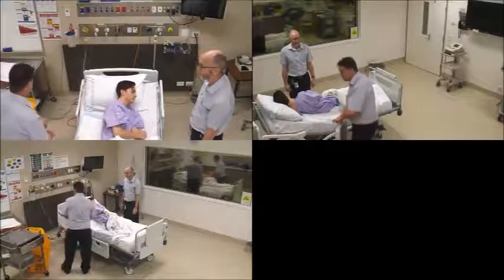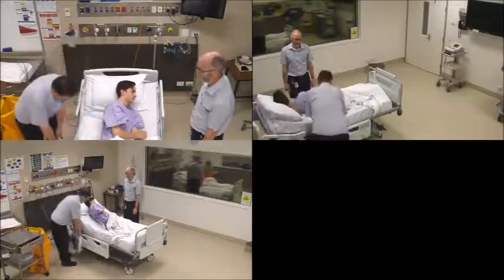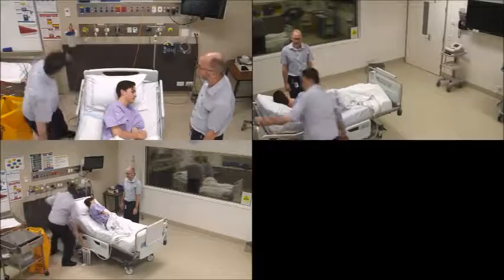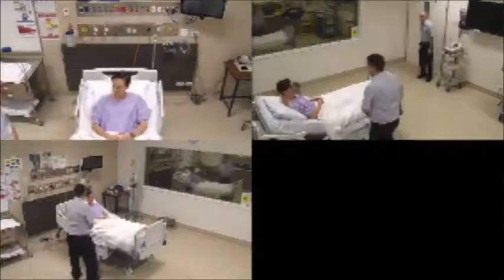Next, position your patient so they're lying on the opposite side to the drain side and place the blue undersheet beside them on the bed. Set your patient up, ensuring you have access to the chest drain insertion site, and check the drainage volume and ensure that suction is disconnected.